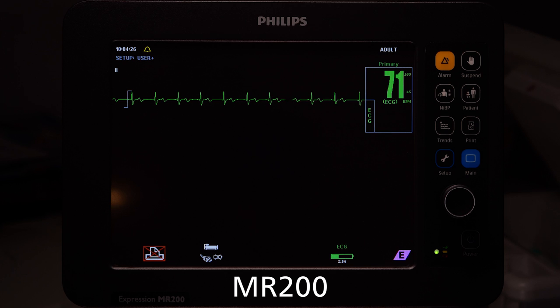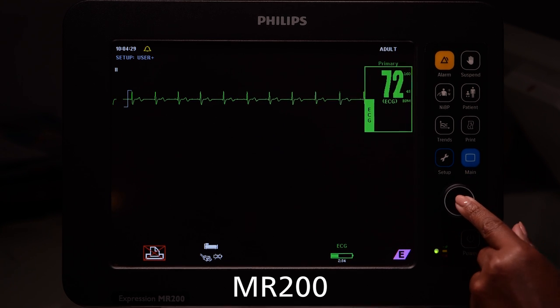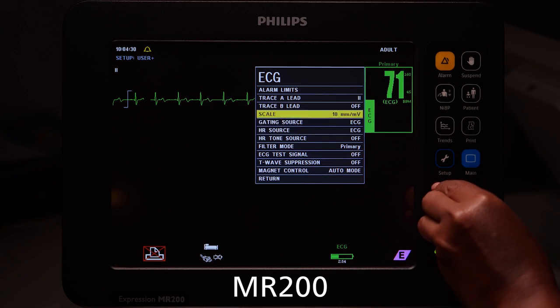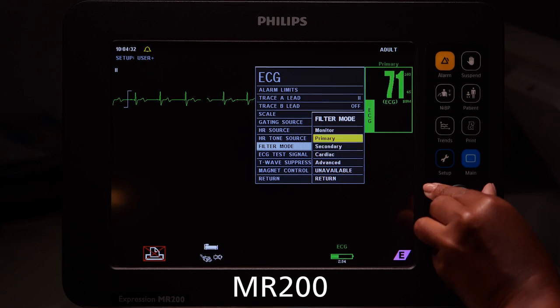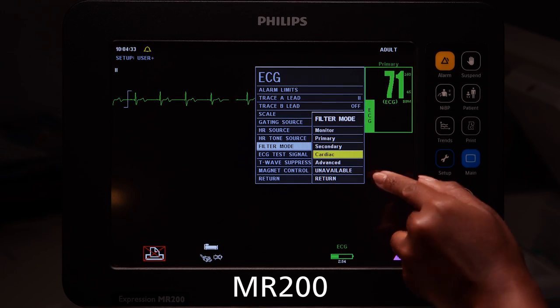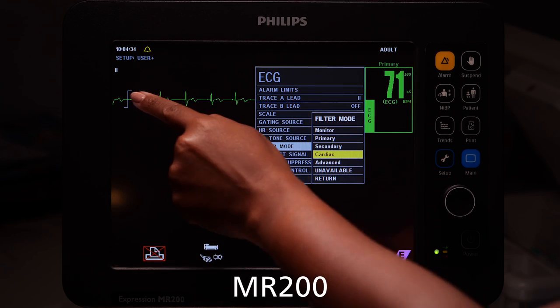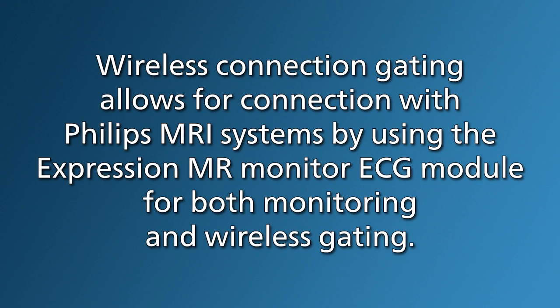On the MR200, cardiac filter in Lead 2 is the recommended filter, followed by Advance 2 filter. Finally, wireless connection gating allows for connection with Philips MRI systems by using the Expression MR Monitor ECG module for both monitoring and wireless gating.